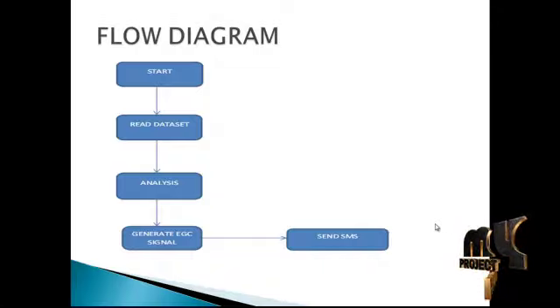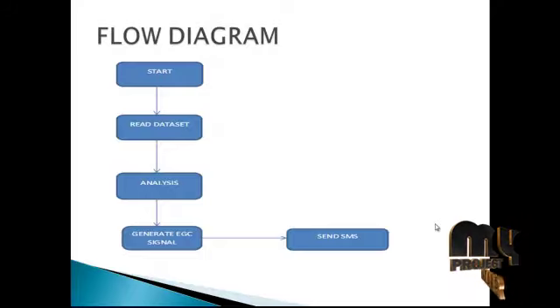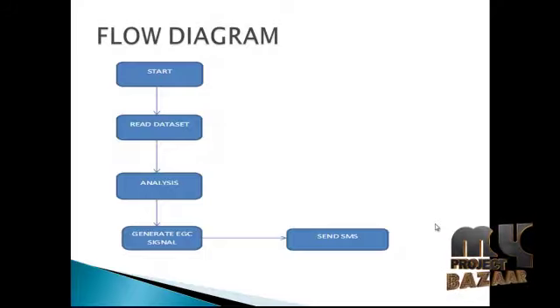Initially, this module is involved with setting up communication with the ECG device using the Android Bluetooth API. After that, getting the data from the device, the next module performs the read and display of the output from the ECG system. The smartphone reads the data from the dataset.